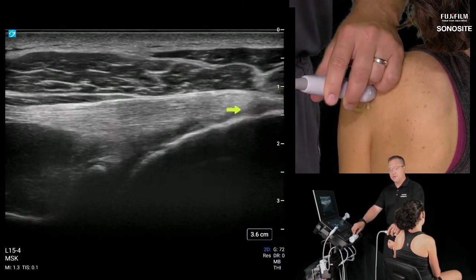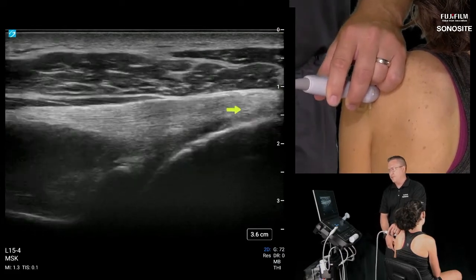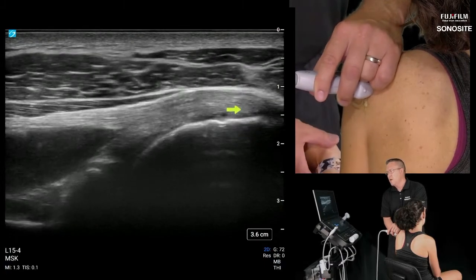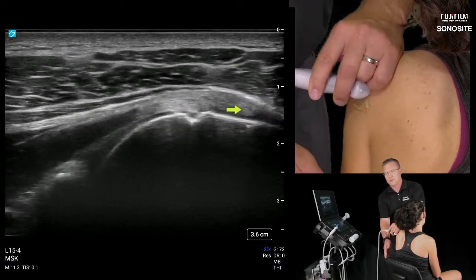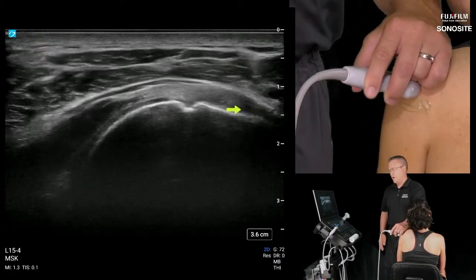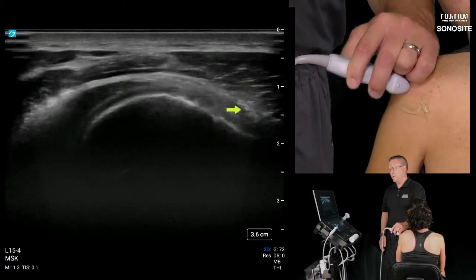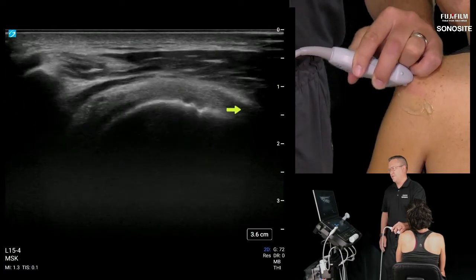Thing is, when we do these exams, typically the patient is in a relatively neutral position. So let's watch where the infraspinatus goes. I'm going to get off track here. And we're going to chase, and I'm going to rotate our shoulder for the camera here. That way we can chase this probe direction down all the way anterior, and we're actually just following the enthesis of the infraspinatus so that you get a general sense of just how anterior it goes.